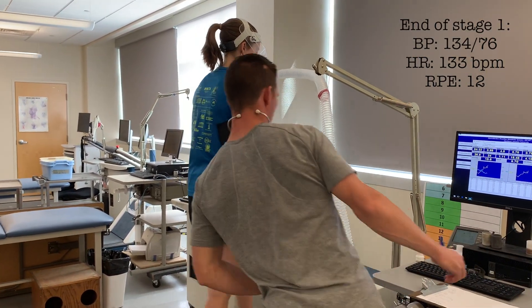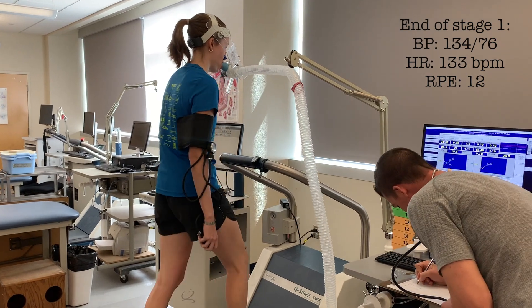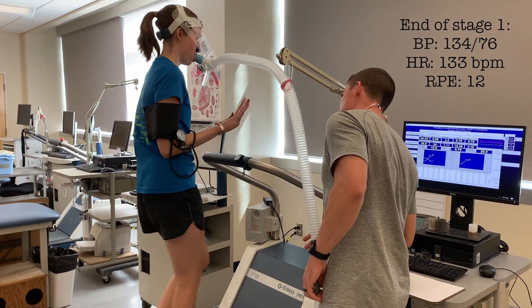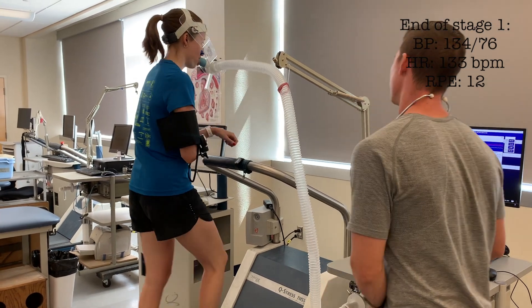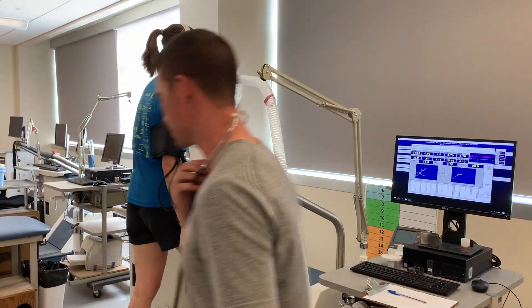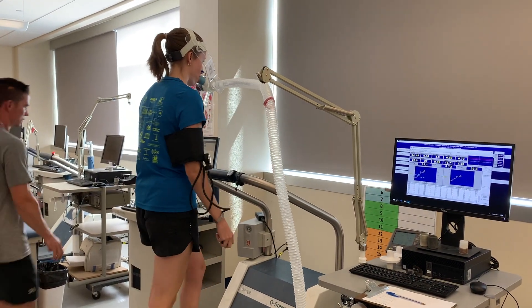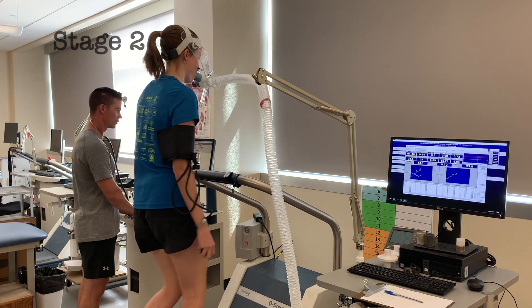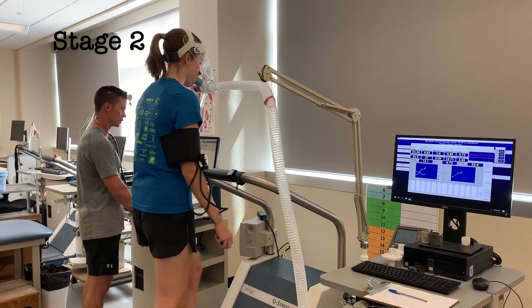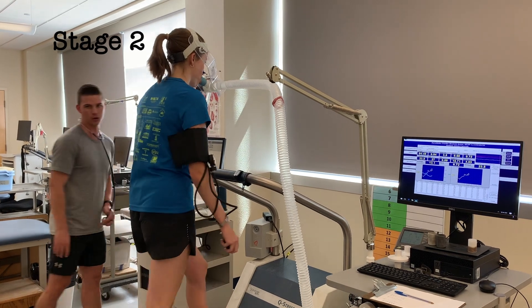Heart rate is 133. What's your RPE? 12. Okay. I'm going to change the grade now, we're going up to stage 2: 2.5 miles an hour and 12% grade.